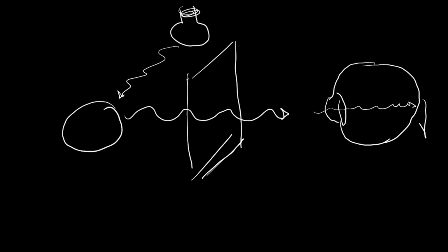And you can imagine that if a bit of the window is ground glass, some of the light will cross less freely through the ground glass part of the window, even though you're seeing the photons on the other side, than in the part of the window that is not ground glass. Now imagine that you put a dime in the middle of the ground glass. You're going to have the same representation as what you're seeing in the window on the retina, but the photons will not be able to cross the metal. So what you're going to see is just a dark spot there, because you really cannot see the light that is coming from that.